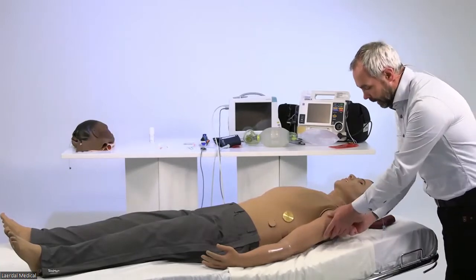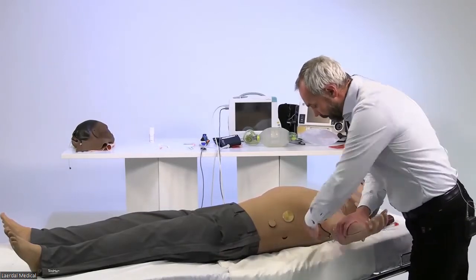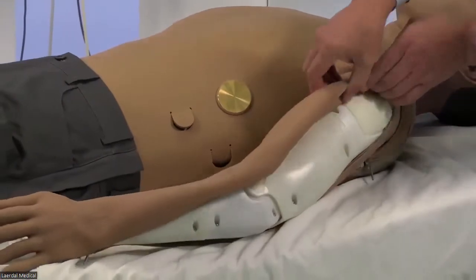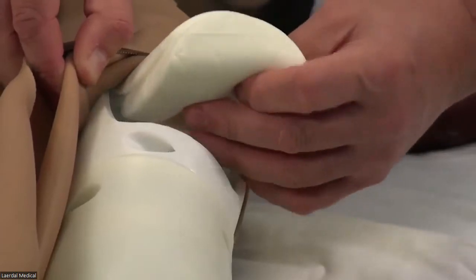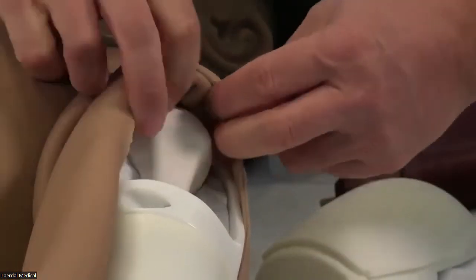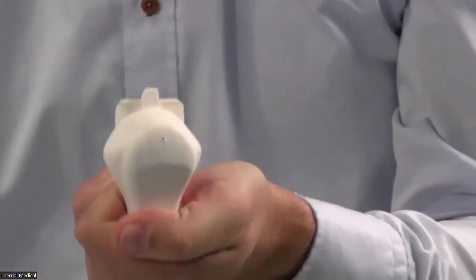So just gonna mention while we're here, as I said, the zipper, the whole length of the arm, I will open it now so you can see the underlying part for the shoulder pad. So if I take this aside, you can see this foam pad, which is the IM area. So this can be taken out. And under the foam pad, you can see the IO bone. This one can also be taken out. And you can now see the one hole from where I drilled.